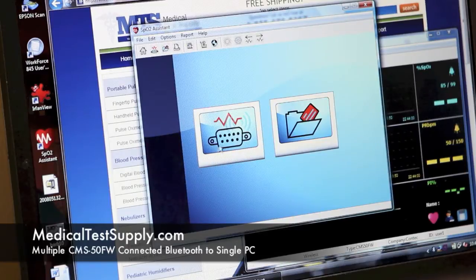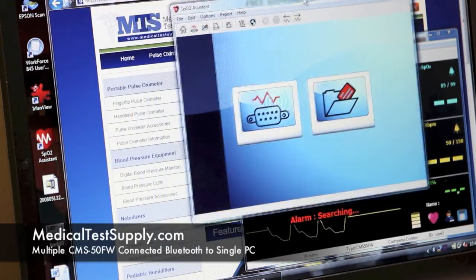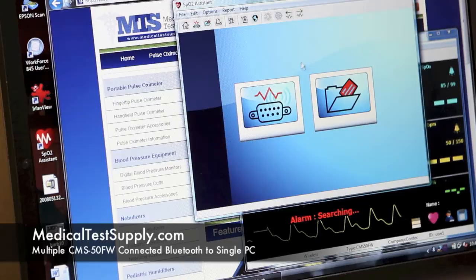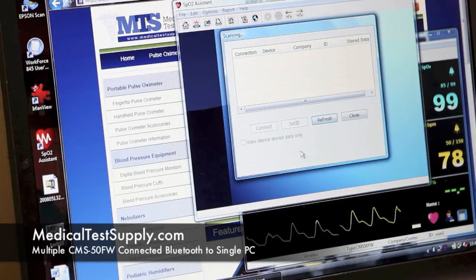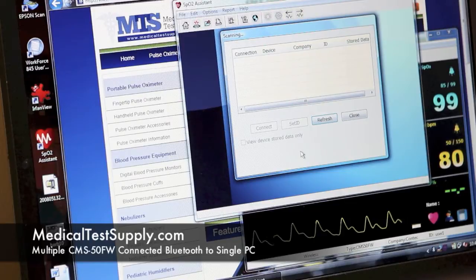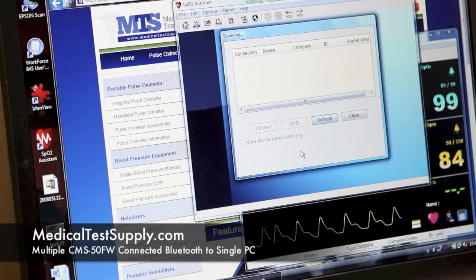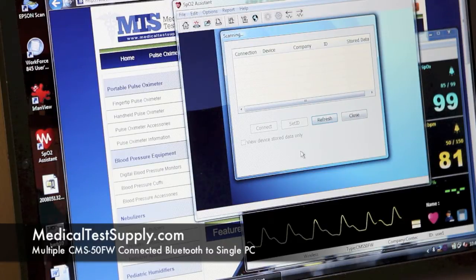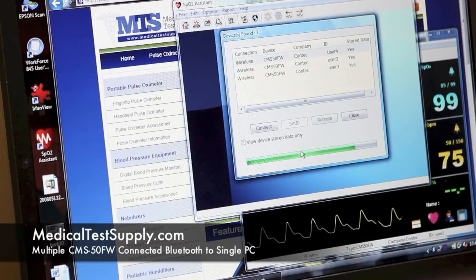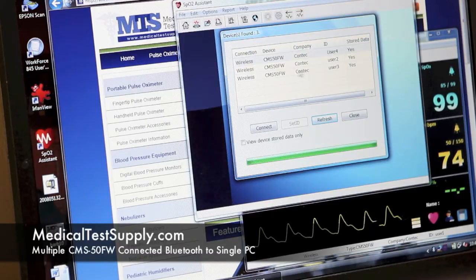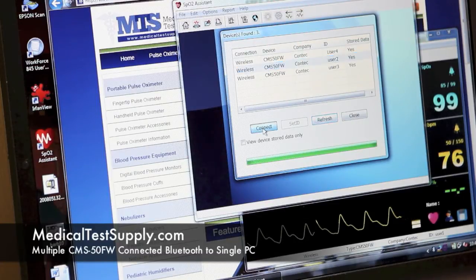We'll start another instance of SP02 Assistant and relocate the window a little bit — we're going to have to fit all these on at the same time. Connect device. You can see the first one started to gather data, so we're scanning again. Now we've found user 2, 3, and 4, remembering that user 1 has already been connected. So we'll connect user 2.